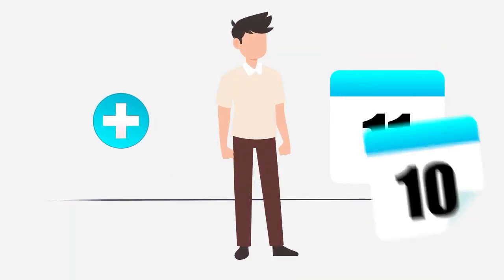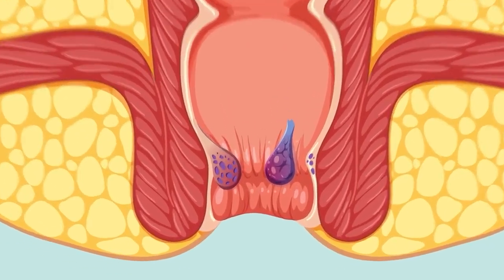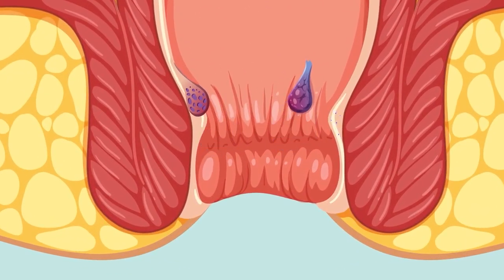hemorrhoidal bundle. After the current is carefully stopped, usually about 2.5 minutes for grade 1 hemorrhoids, 3 to 3.5 minutes for grade 2, and up to 4.5 minutes for grade 3, these crucial changes occur and the treatment is then considered complete. The patient is then safely released and the enlarged bundle gradually and progressively shrinks over time. Usually after a period of 10 days to 2 weeks, there is absolutely no trace of the bundle left whatsoever.